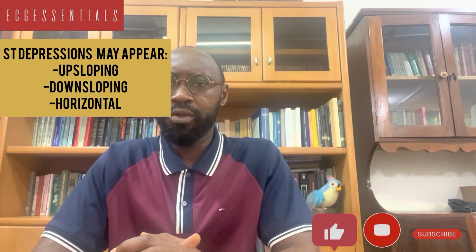And some texts explain that downsloping and horizontal ST depressions may be more specific pointers to an acute myocardial ischemia, as opposed to an upsloping ST depression. But again, it depends on which patient is sitting right before you, and that should guide your interpretation.